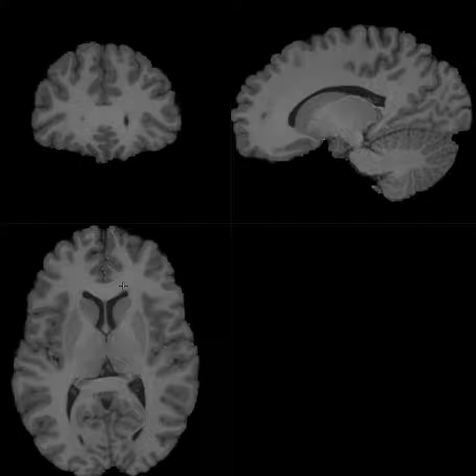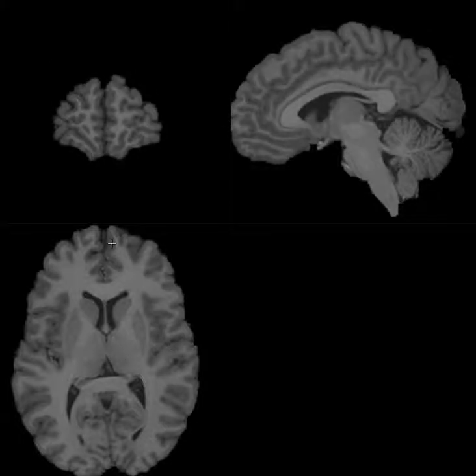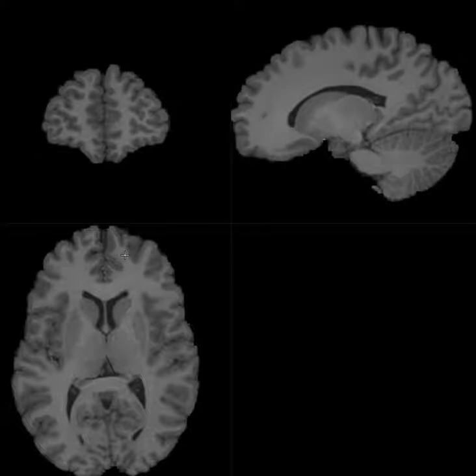And when I speak about contrast, we're saying the contrast between this tissue over here, this gray matter tissue over here, and the white matter tissue over here. And when I say over here, I mean look at the cursor that's moving right there, right? Okay, so that's the T1 weighted image.